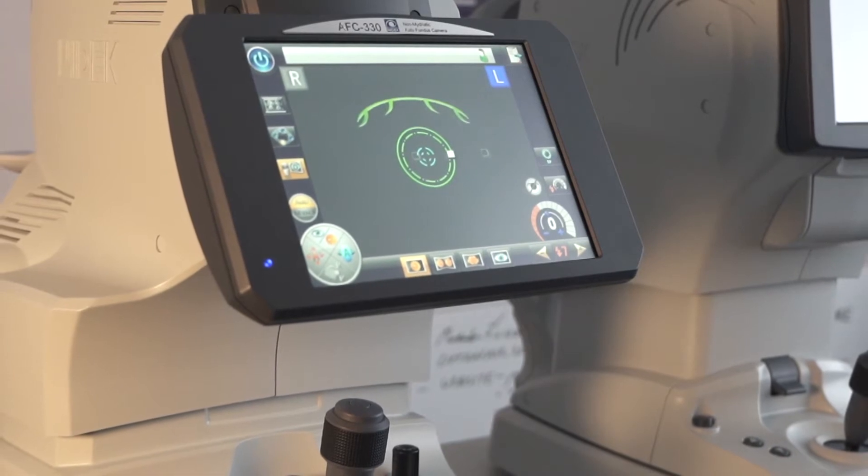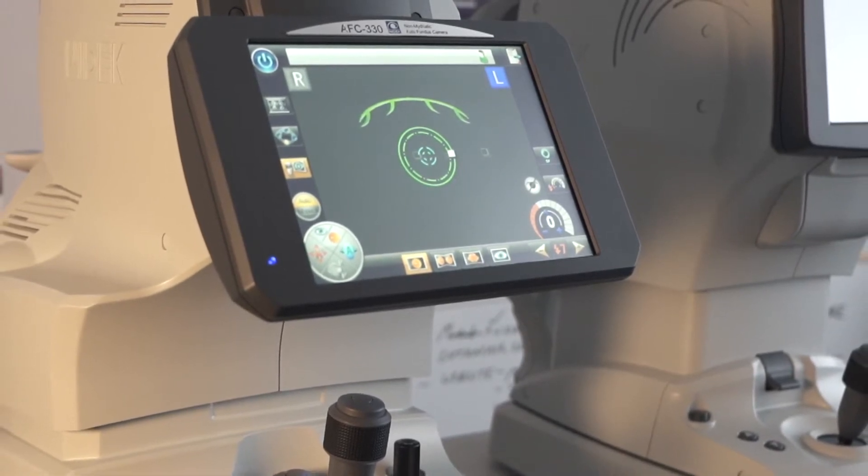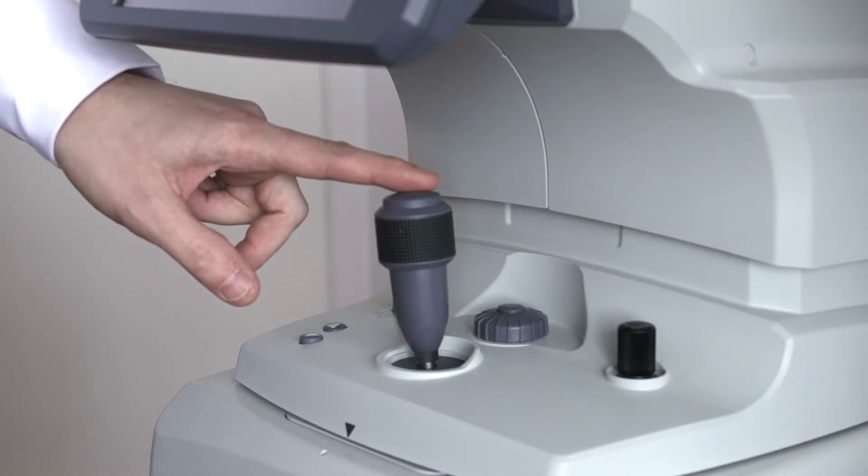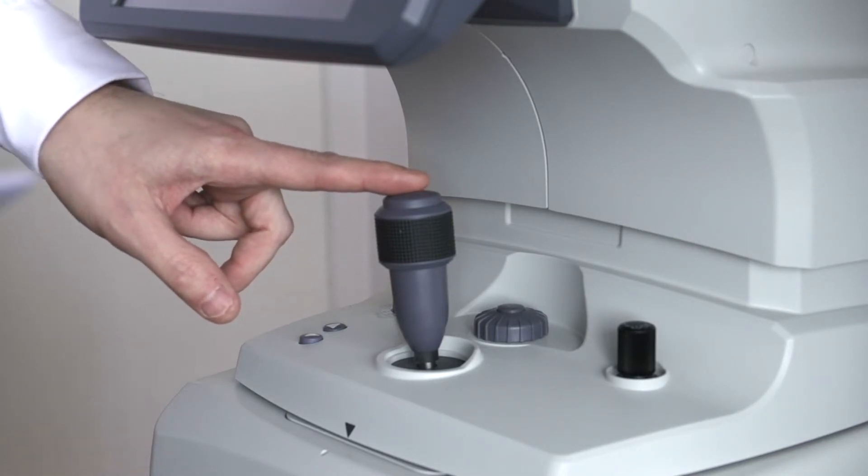It will also blink when it goes into sleep mode. On the actual device itself, we have the release or capture button. This is used to actually manually capture in manual mode.